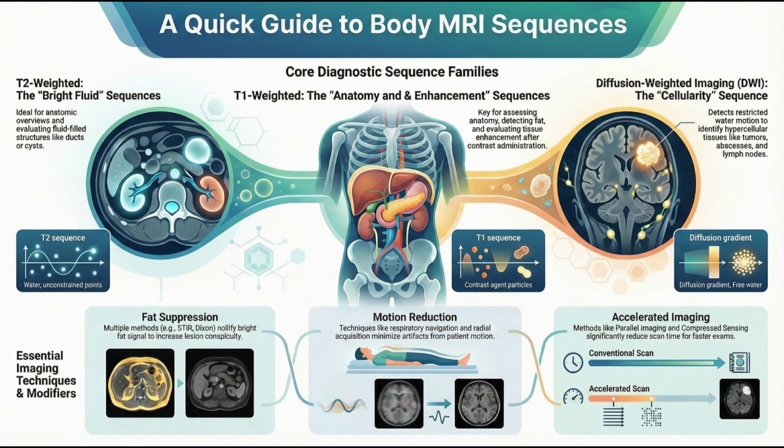So if parallel imaging was the evolution, then I feel like compressed sensing, or CS, is the revolution. This is where you see the vendor names, right? Yeah. Hypersense, compressed sense. The name doesn't matter.